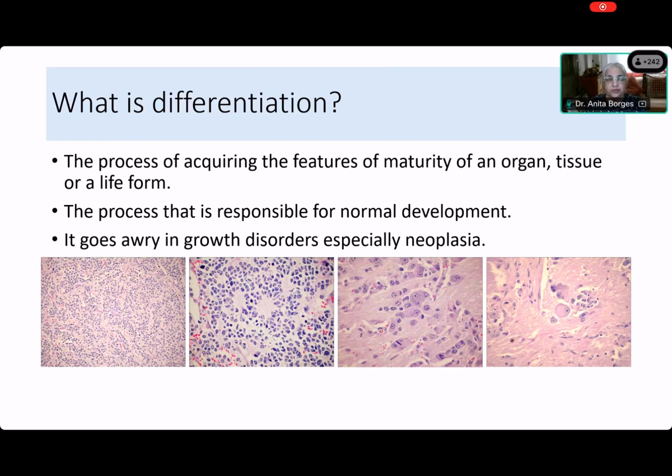All right. And Navneet, I'll tell you that all these four pictures are related to one another. Now, what do you think all these four pictures actually mean? Yes, anybody. If it's not Navneet, then anybody. All the third year guys. Come on, Sakshi. The third one is differentiated into squamous cells. Squamous cells. Achha. And the fourth one has mucin in the cells. Okay, all right.